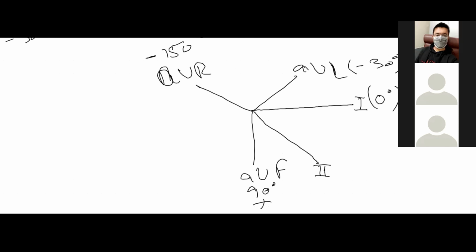And there we go for lead 3, which lies at positive 120 degrees, right?